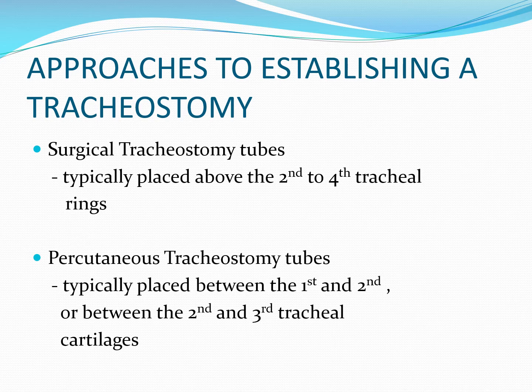Many of these patients have an endotracheal tube in place already, so there's great coordination between the physician doing the procedure and the respiratory therapist, managing the patient on the ventilator, and, on the request of the physician doing the procedure, gradually removing the endotracheal tube, and only removing it once end tidal has been confirmed through the tracheostomy tube.